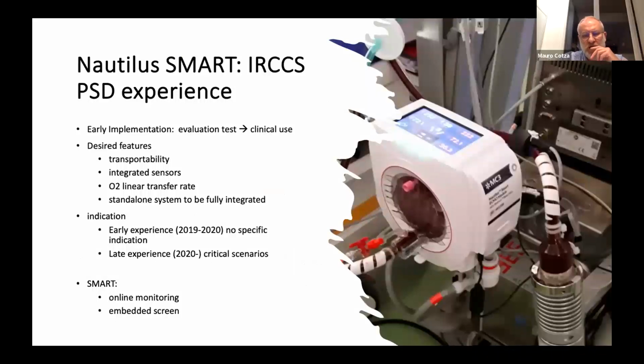So how did we move to Nautilus Smart oxygenation? We moved considering those principles. We started in the ECMO in the pandemic wave era. We had an early implementation, from the evaluation test to a standard clinical use.